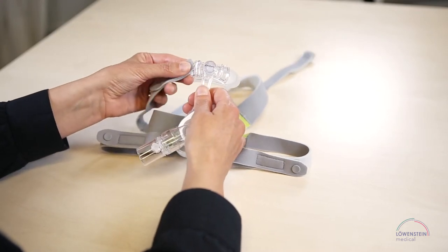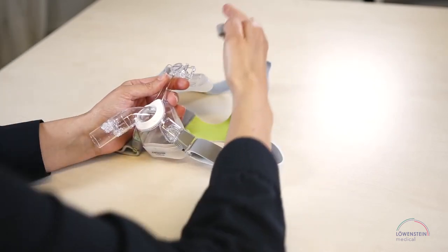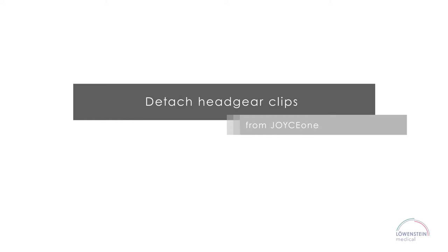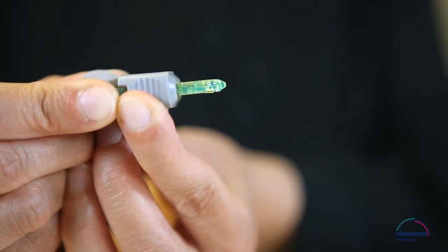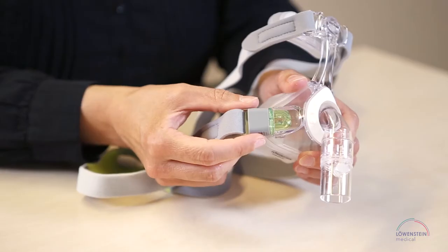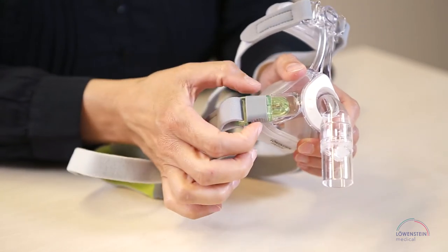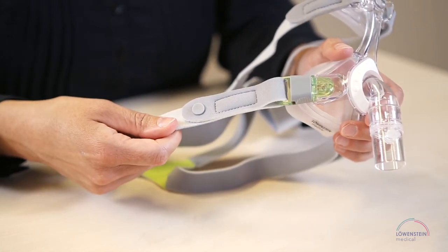Fasten the upper ends of the straps to the mask. The clip has two small hooks up front. When you squeeze and pull the gray connector backwards, the hooks are pushed down and the clip detaches from the mask. The clips do not detach if you simply press the clip or pull on the headgear.